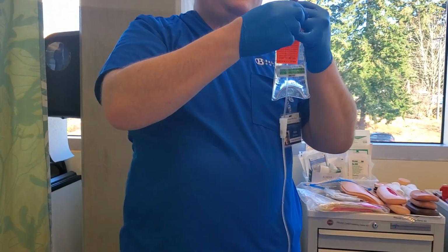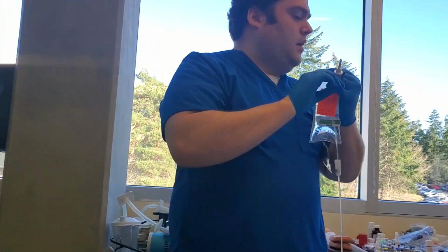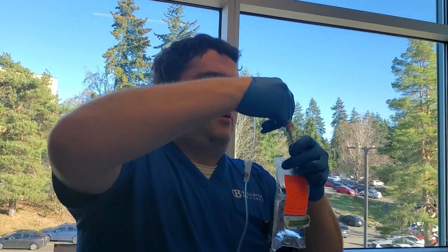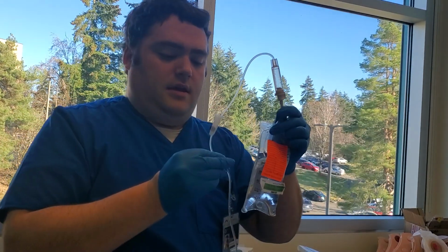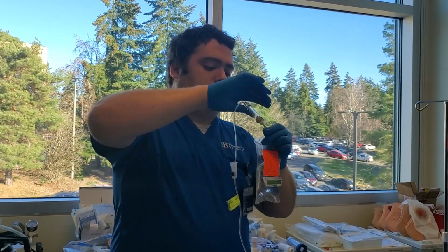Oh, there's someone right there. And that will go ahead. This is going to be the label I'll put down right here, 72 hours. And there's that. Let's make sure there's a good one in here.